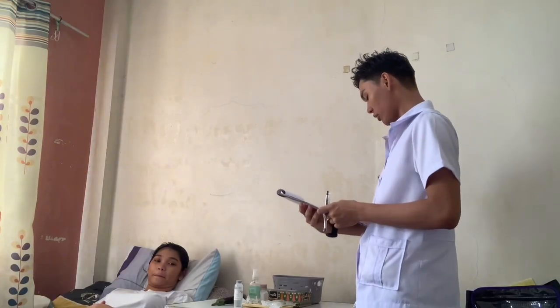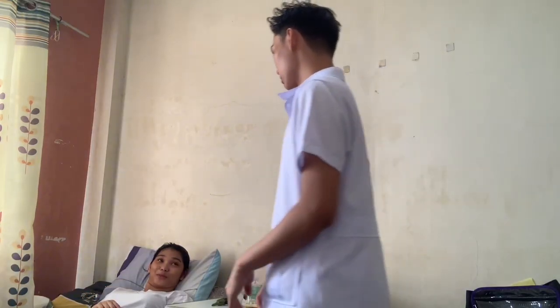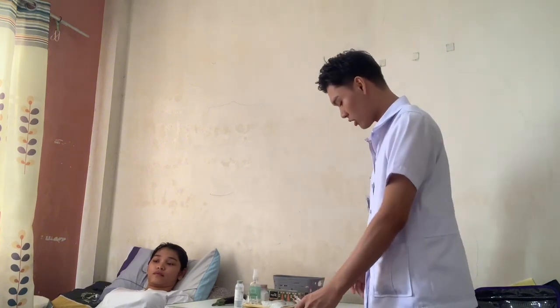Today, ma'am, I am going to perform a subcutaneous injection to your shoulder. Before doing the procedure, I am going to assist the patient into a comfortable position. Now, after doing that, we will educate the client regarding the medication that has been prescribed by the doctor.